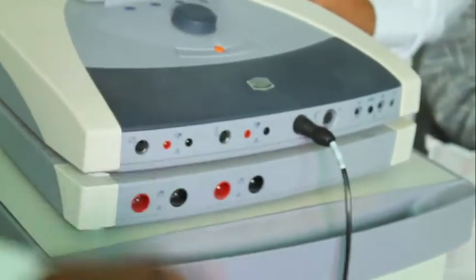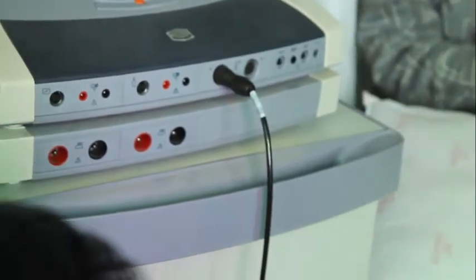All the machines don't come with 2 channels. There are some machines where only 1 channel will be there.